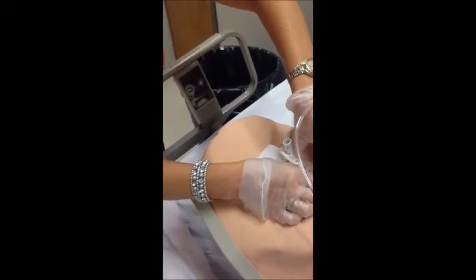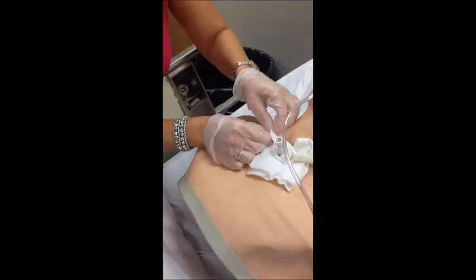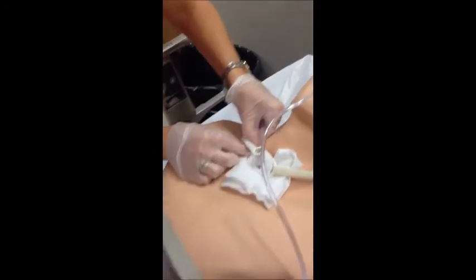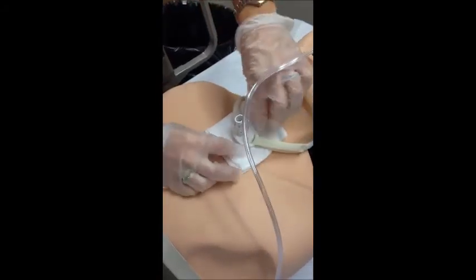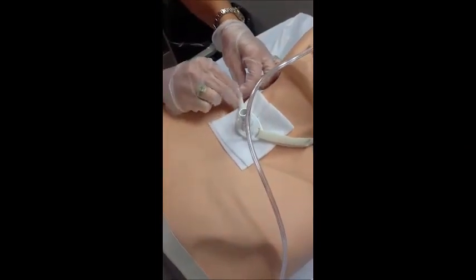Hemostats are a wonderful thing right now because they're tiny and they can sometimes squinch back up in here for you when you have trouble with your hands being a little bit too big, which I have small hands, but I'm still able to do it. Get that in there straight as you can. Now our ties, a lot of times the ties are gunky.